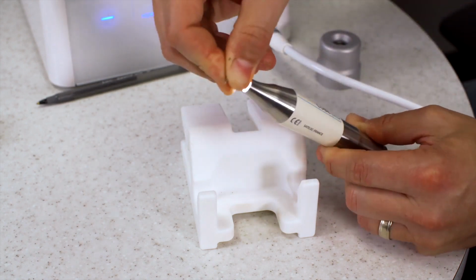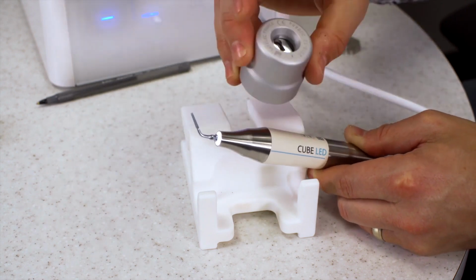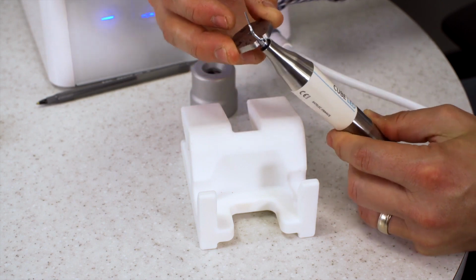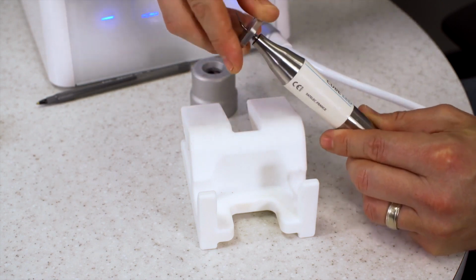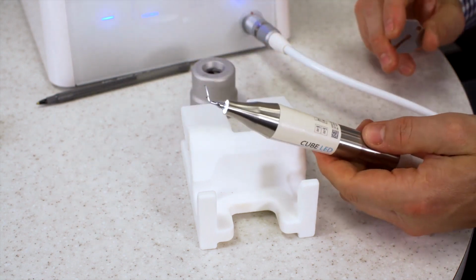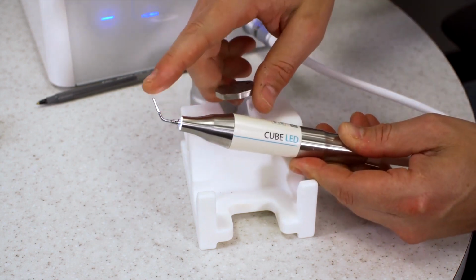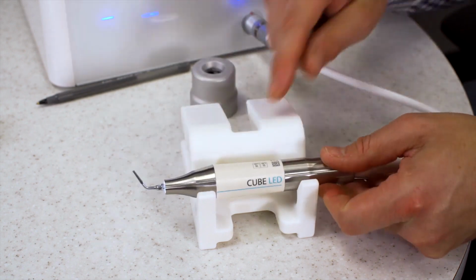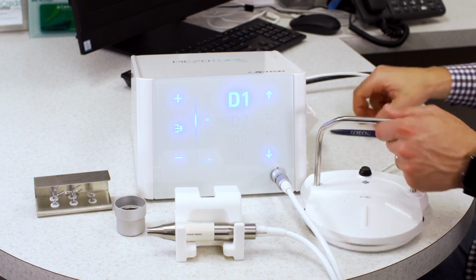You can insert your tip, start to screw it in by hand, and then tighten it with this big lug wrench, or they also provide a smaller one here for easy access. That just slides down and tightens like such. And then when you push on the handpiece, you get light, you get ultrasonic vibration at the tip that cuts hard tissue, and you get water spray as well. So that is how you activate and control the handpiece.